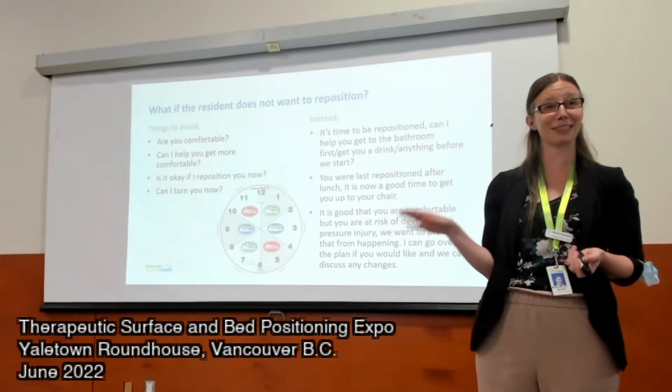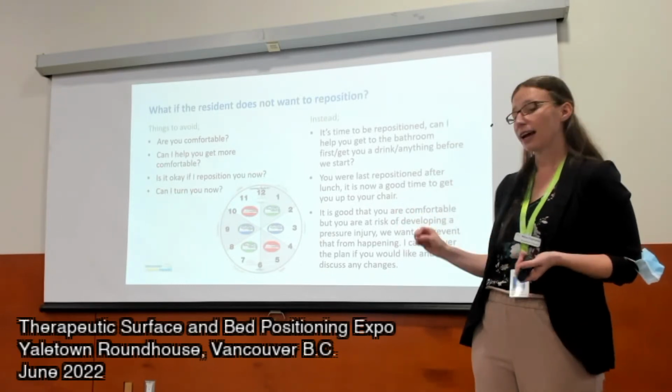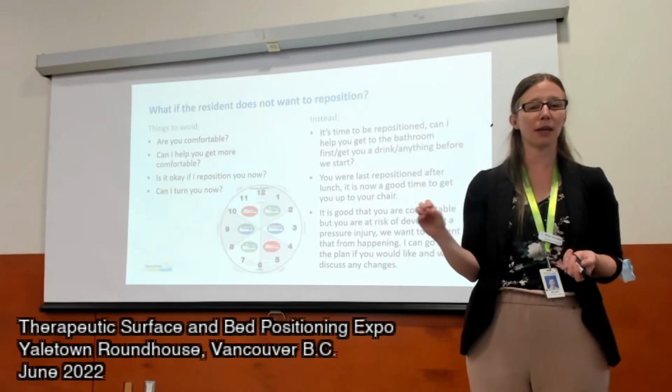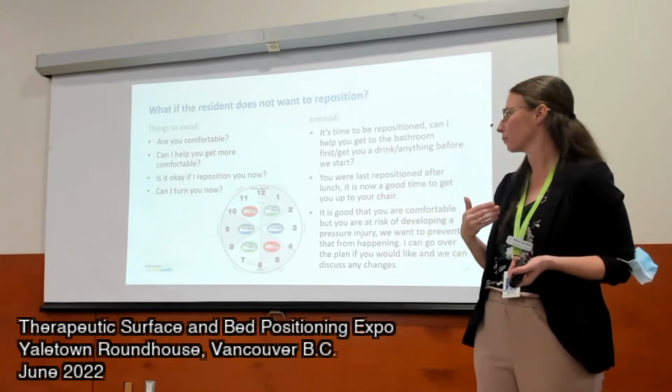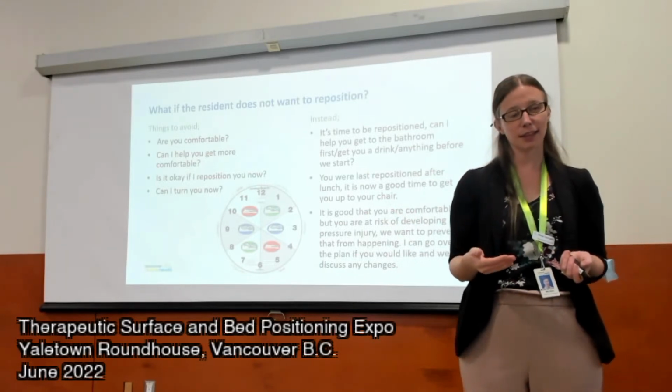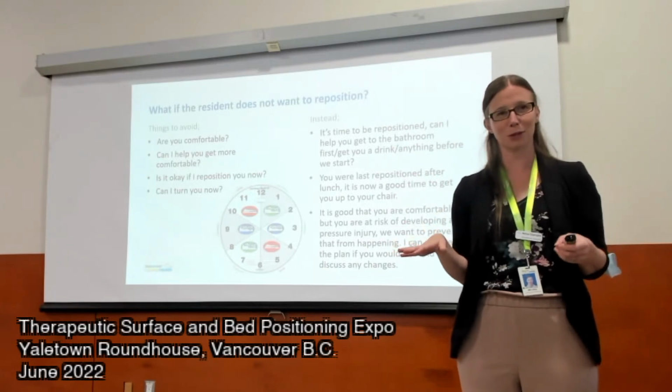Some people might still say, I do not want to be repositioned. In that case, we need to make sure that they are making an informed decision. So all those education pieces have been in place, and if that's the case, we need to make sure that we are looking at the different support surface options.